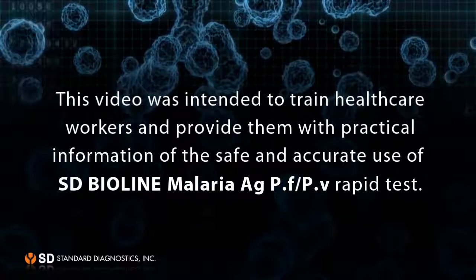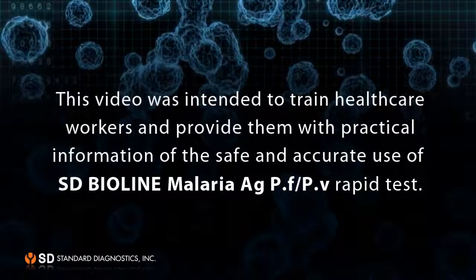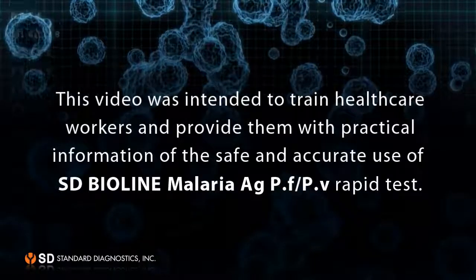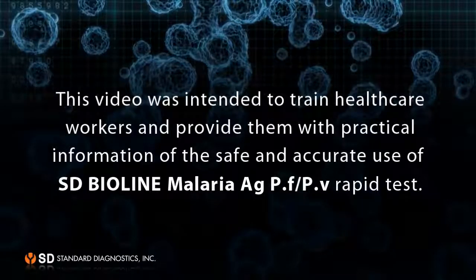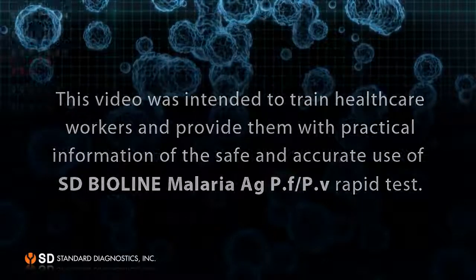This video was intended to train healthcare workers and provide them with practical information on the safe and accurate use of the SD Bioline Malaria Antigen PF/PV rapid test.